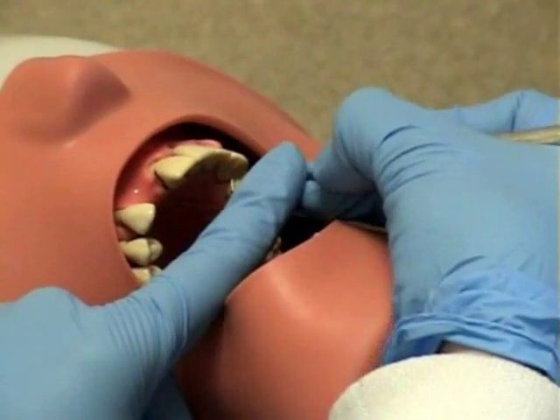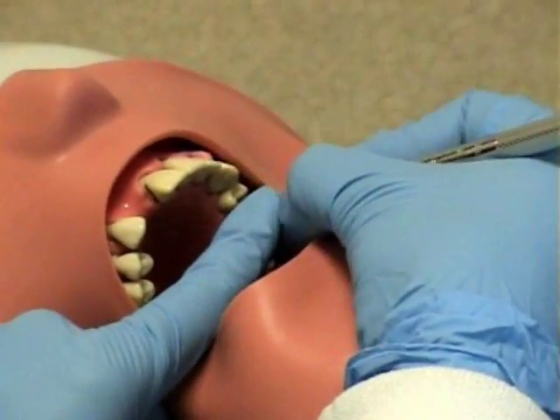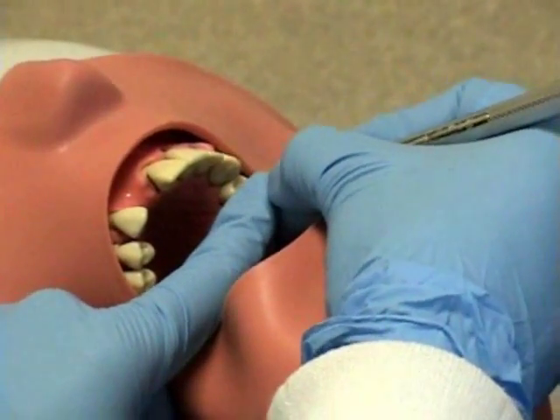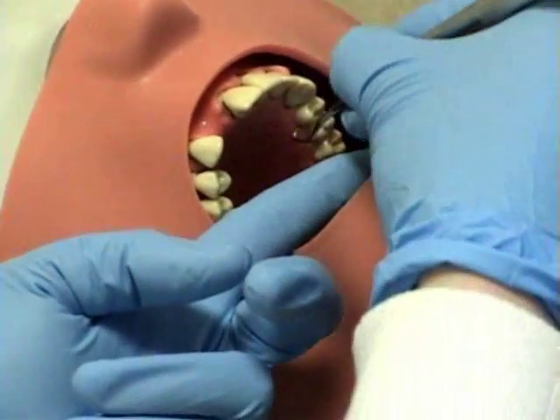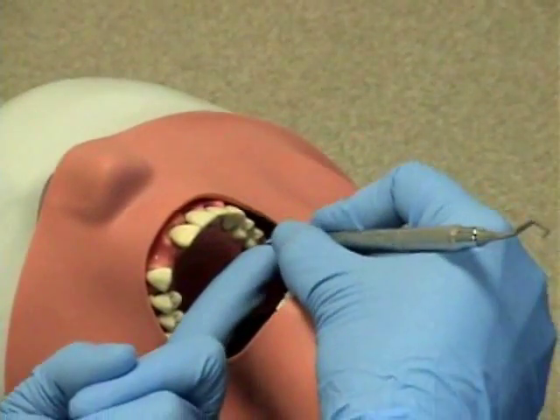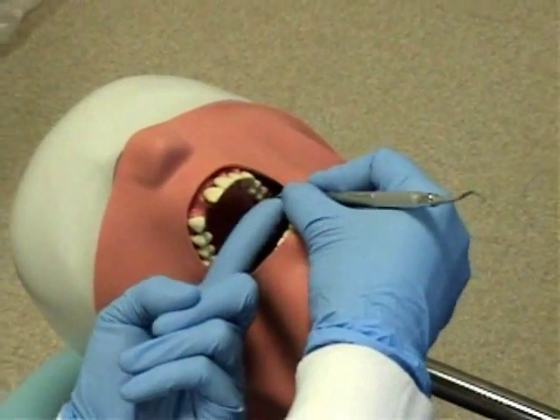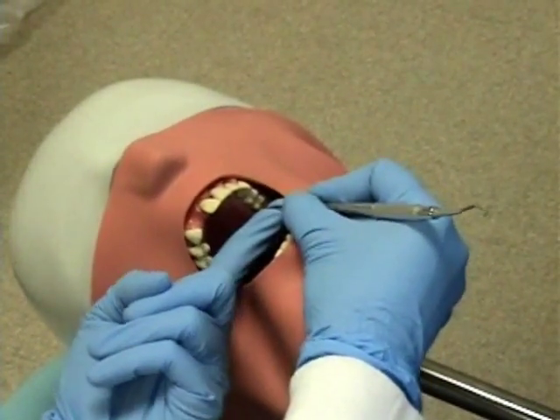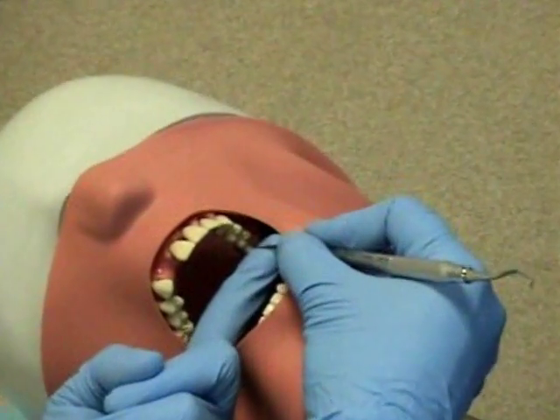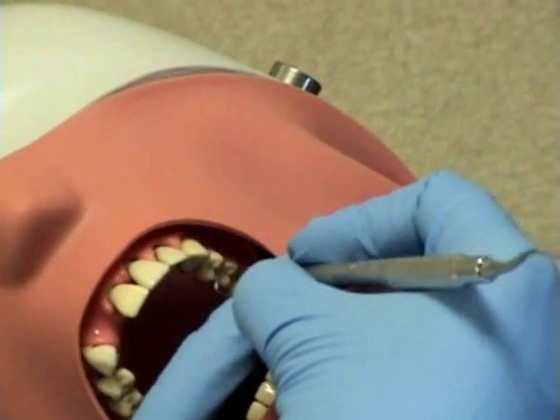The pressure is pointed posteriorly with an 11-12 instrument. The extraoral palm up reinforced with a 13-14, the pressure from the non-dominant hand is pushed anteriorly to provide stability to the instrument and added lateral pressure.